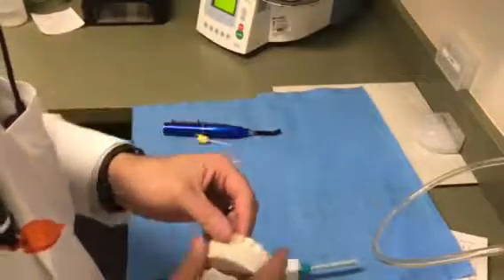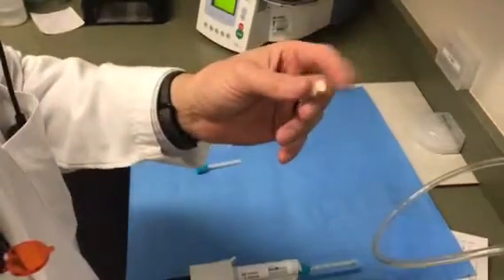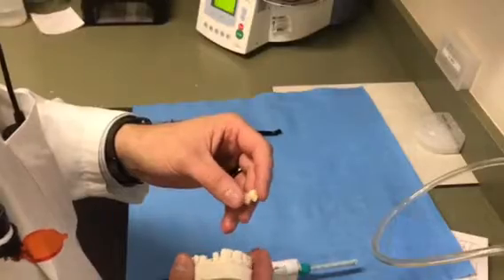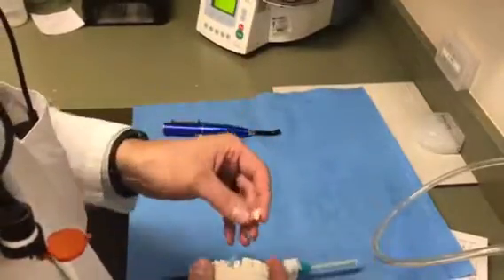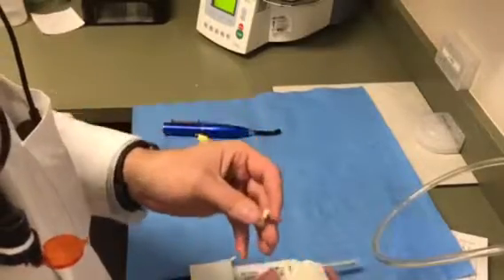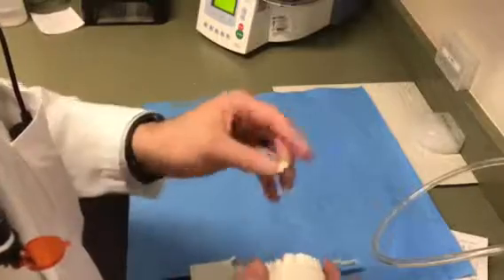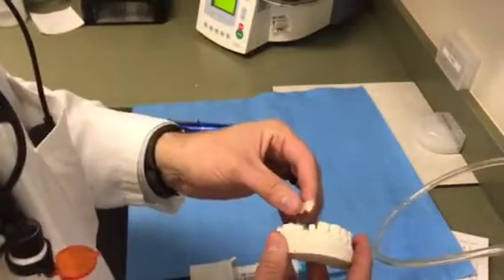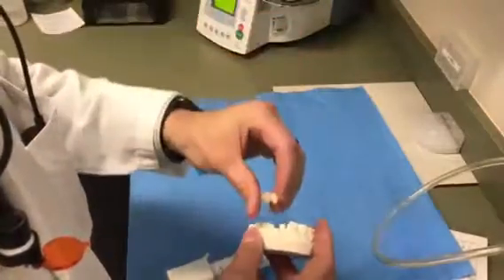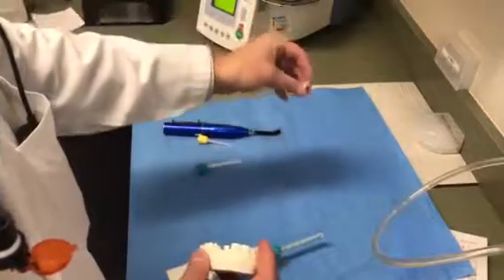So the first and easiest method that I use: let's for a second pretend that this wasn't fitting in the mouth, and we had an open contact on the mesial of this tooth number 10. My first step is actually to shave the model. Let's backtrack just a little. The contact is closed on the model, but when I take it to the mouth, the contact is open.